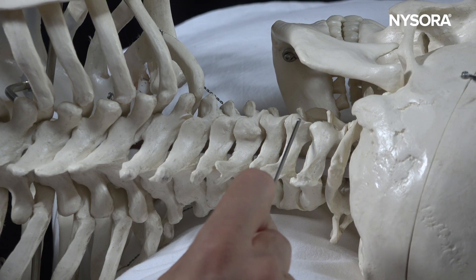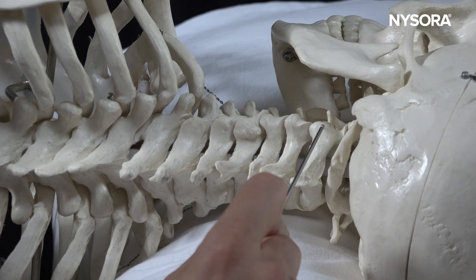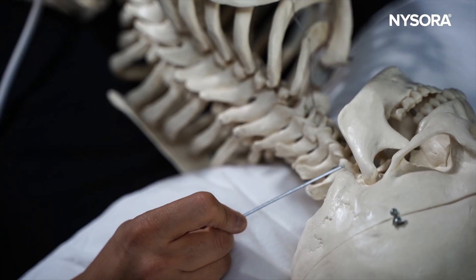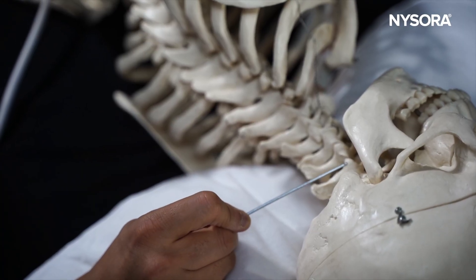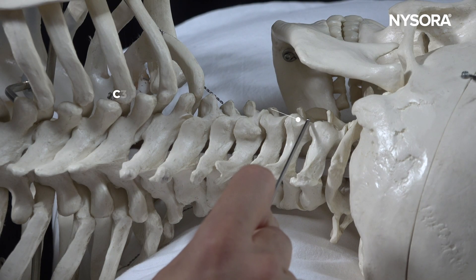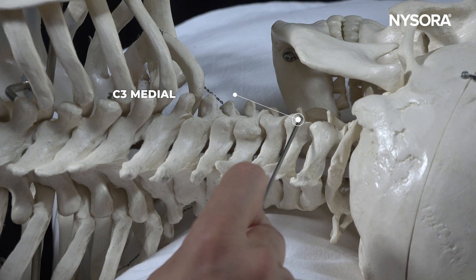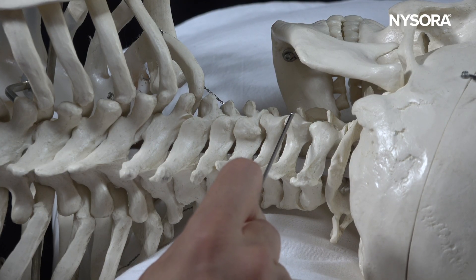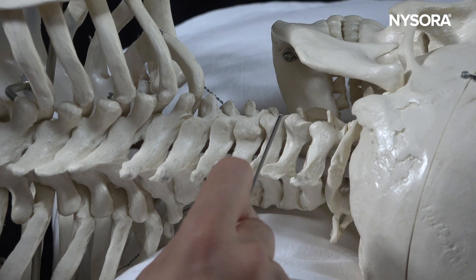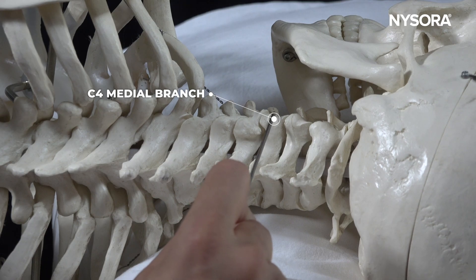At the C2-C3 joint, the nerve structure located superior to it is the third occipital nerve. Then you have the peak which is the C2-C3 joint, and a trough where you will find your C3 medial branch. Then you have the C3-C4 joint as a peak and a trough where you have your C4 medial branch.